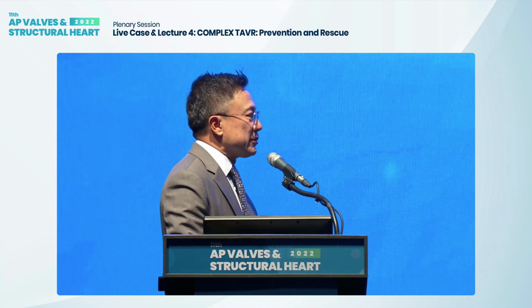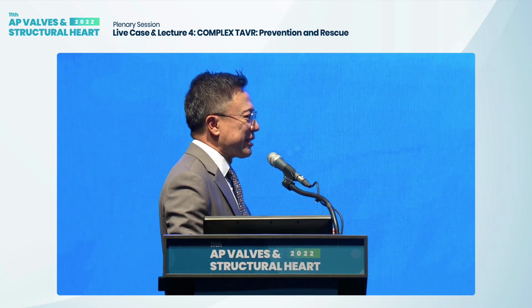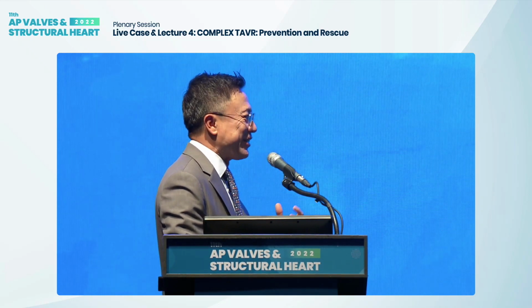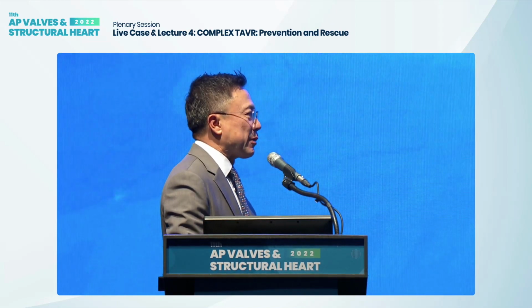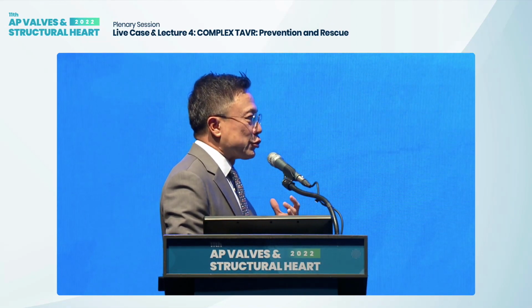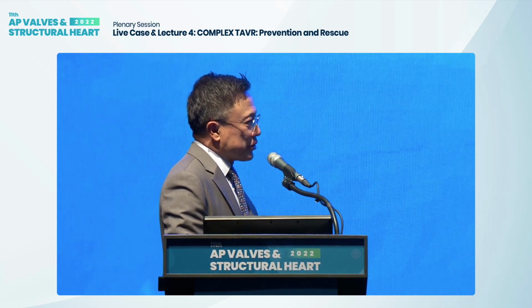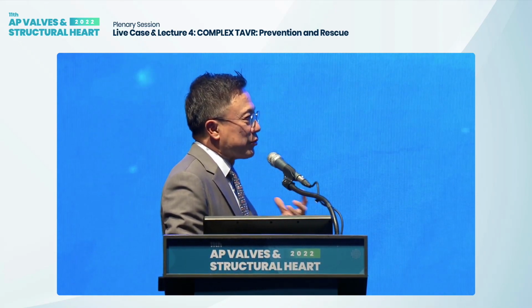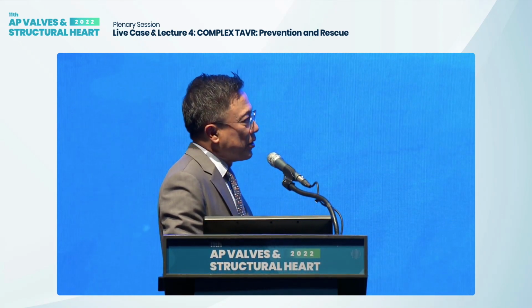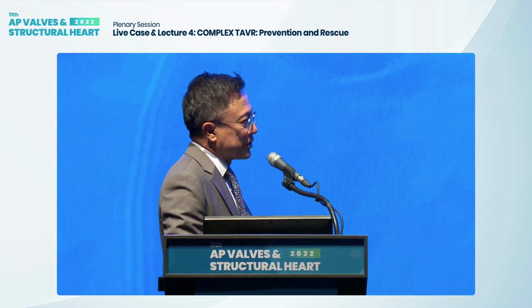There are obviously people working on trying to decalcify the valve, and I think that will be hard, like putting a balloon in one side or the other and bathing the valve in some sort of solution. I think that would be a pretty difficult way to do it. You may be able to do it with the True balloon, which has a valve inside, and you could treat the valve like bathing it in a solution while the inside has a temporary valve working. But I think all those are a big stretch, doing a lot of stuff for something that maybe does not have a great return.